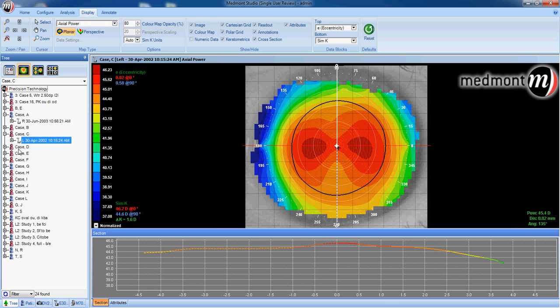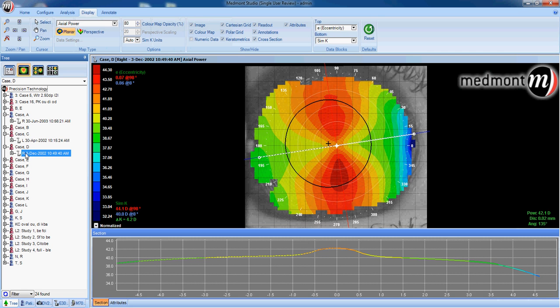Compare this apical or centralized corneal astigmatism to what's described as limbus-to-limbus corneal cylinder or astigmatism. In this particular case, the figure-eight or bow-tie is not centralized to the pupil — it very much extends from one side of the eye to the other. We can observe that this patient has with-the-rule corneal cylinder, but dissimilar to the first patient analyzed, it is not centralized; it is limbus to limbus.